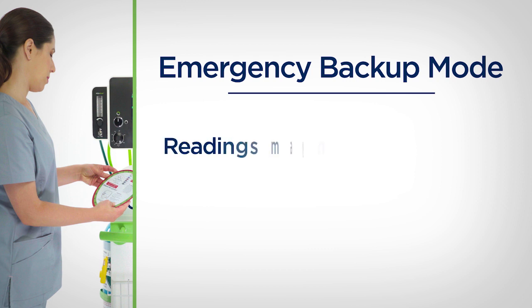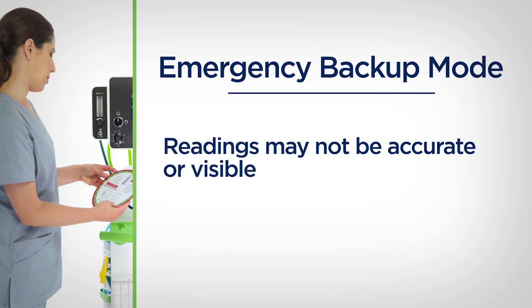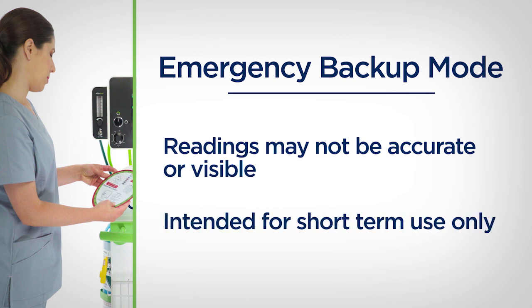Note, monitored readings in emergency backup mode may not be accurate or visible. The emergency backup mode is intended for short-term use only while the unit is replaced or the power issue is resolved.